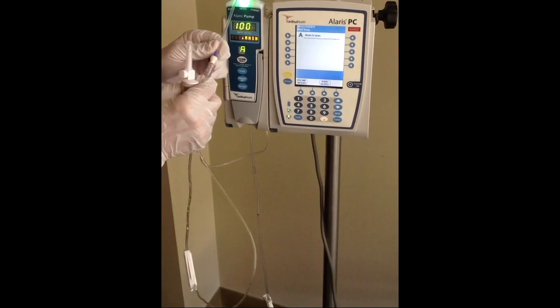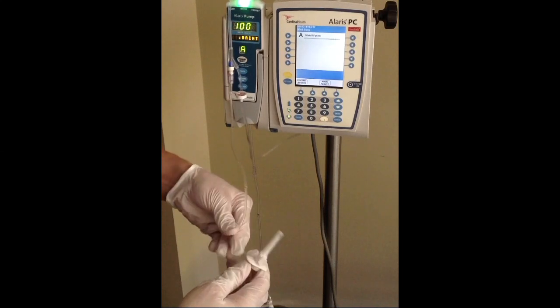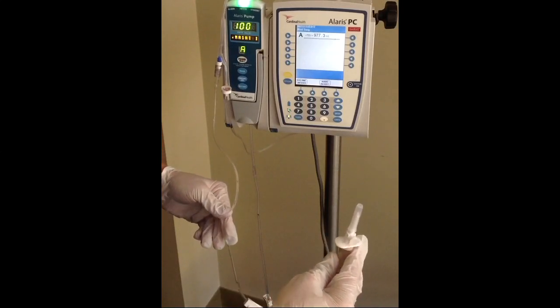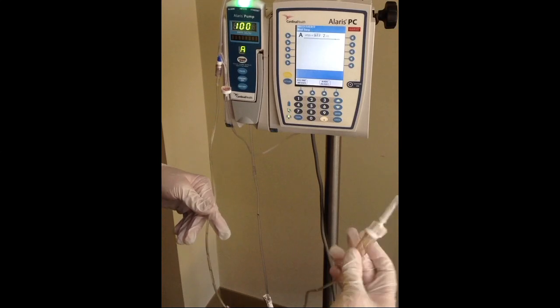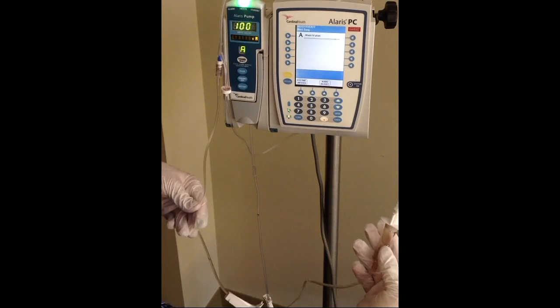Now that we've waited our 15 seconds for it to dry, we're going to connect our secondary tubing and back prime our tubing. In order to get this to back prime, we're going to have to loosen the cap there so that air can escape, and then allow that to back prime. And there's our fluid back priming in there. We're going to wait till our drip chamber is about 2/3 full for secondary IVs.